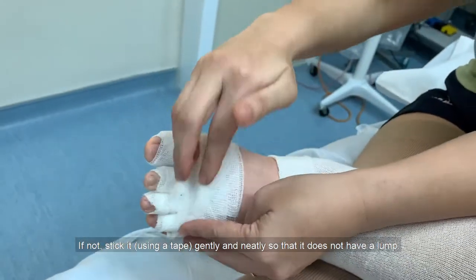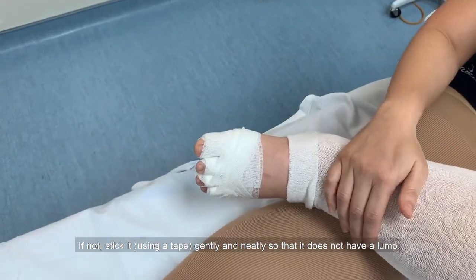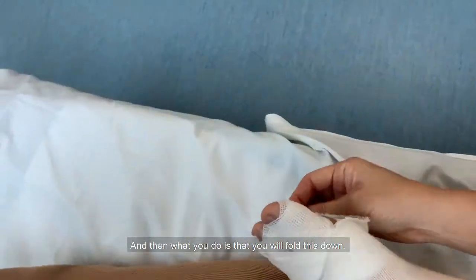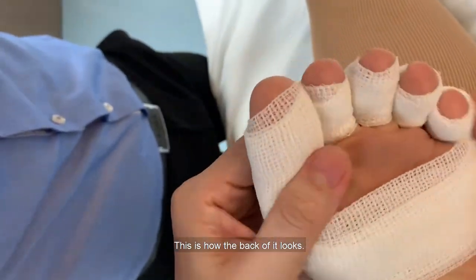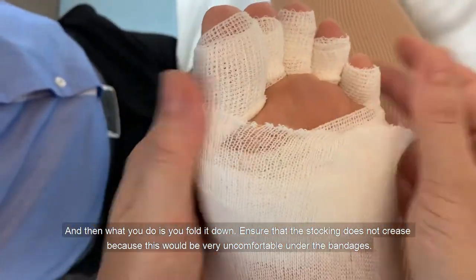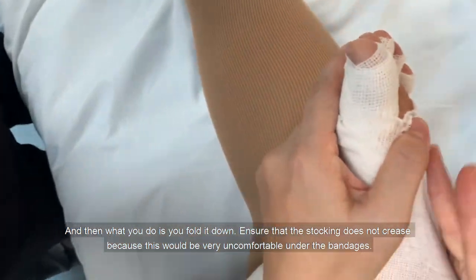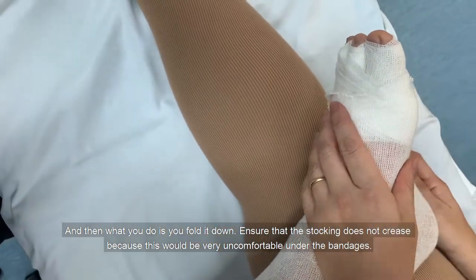If it doesn't hold, stick it gently and neatly so that it does not have a lump. Then fold the stocking down. Ensure that the stocking does not crease because this would be very uncomfortable under the bandages.